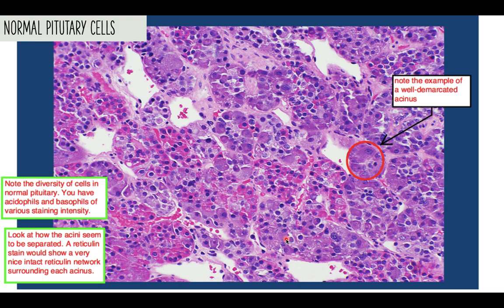These cells intermingle with each other in a checkerboard-like appearance and are arranged in an acini pattern. Acini means a small cluster of cells or a sac-like cavity in a gland.